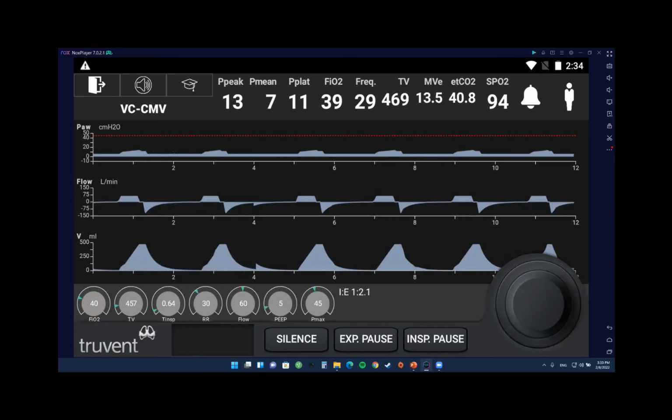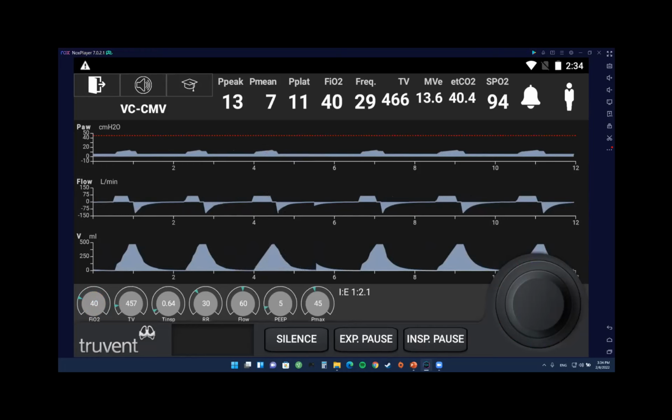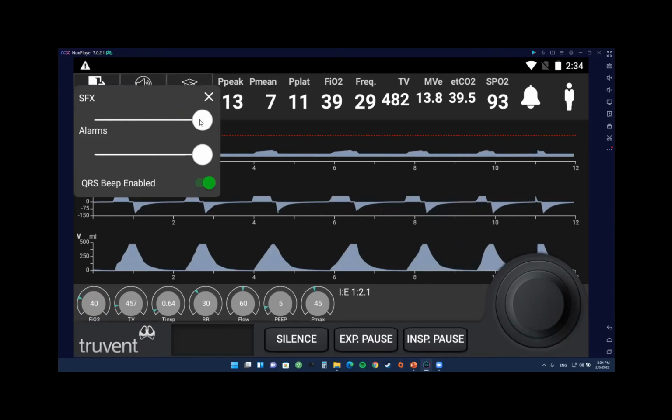Sometimes, for example, the ED does that because nobody's watching the patient. Sometimes the patient is not connected to a monitor, they don't have enough staff to see it. So it's safer to keep them on 100%. But if the patient is on the unit with a bunch of staff taking care of the patient, you have to start doing part of the weaning process. Okay, any questions so far before I move to the next case?